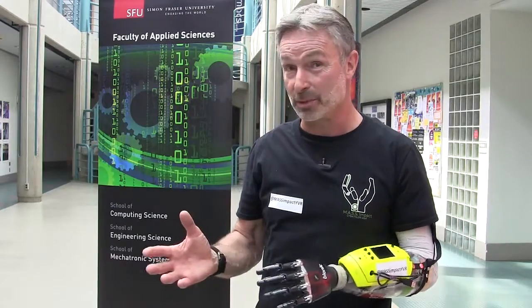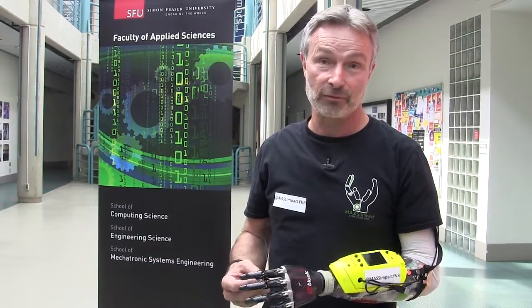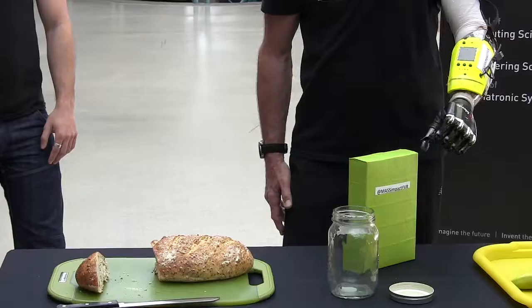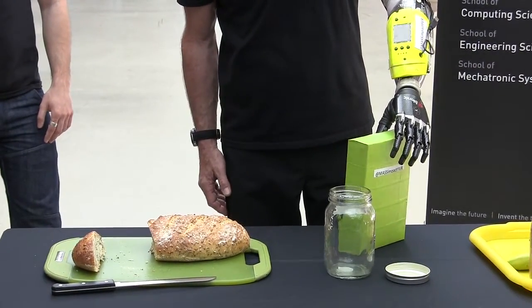Bionics is of course a tremendous thing, but that involves multiple surgeries — whereas with this, there's no surgery. You get fit, you put it on, you test it, and you work it.